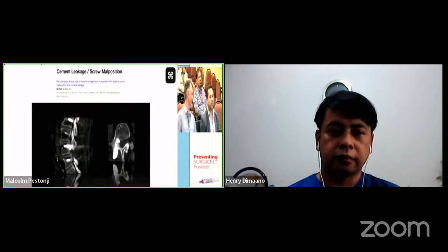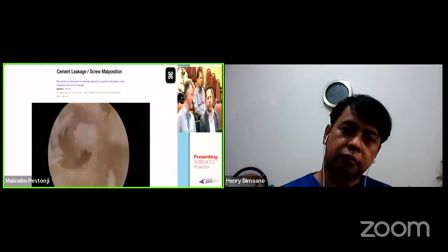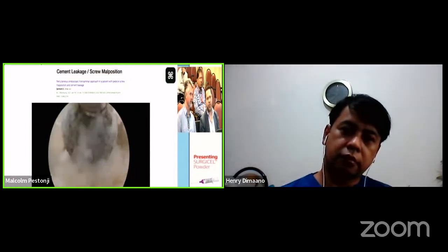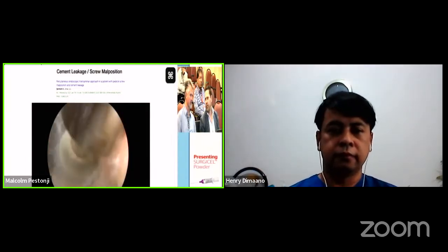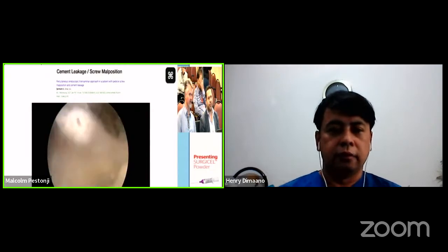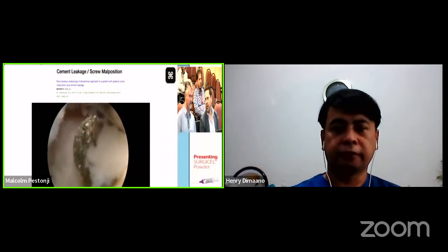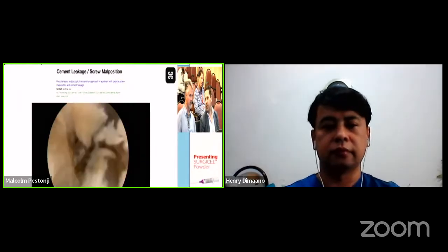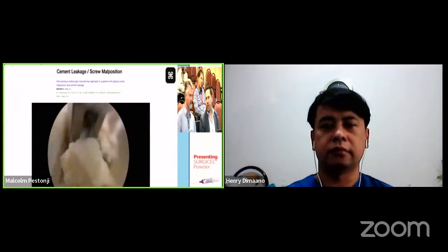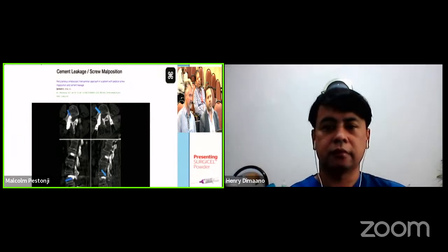Here is cement leakage, and we use another translaminar approach. We follow, and with the tip of the shaver, there is a cement leak part and a screw part, the screw and cement pushing on the tissue. Now we are removing all the pathologic parts of screw and cement. And on the postoperative CT scan, you may see we removed all of it.